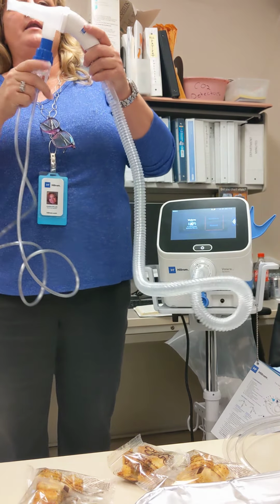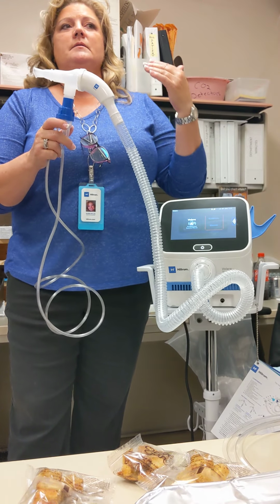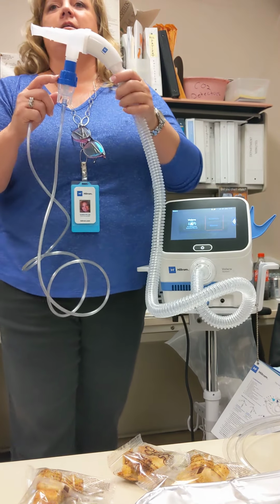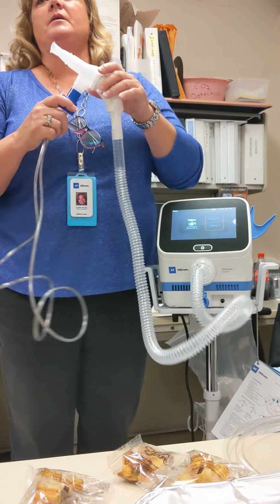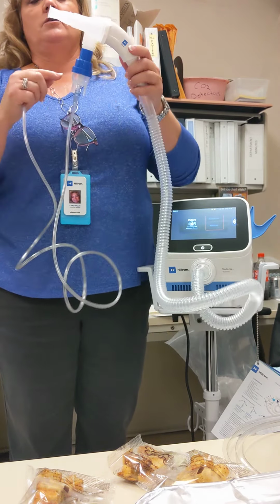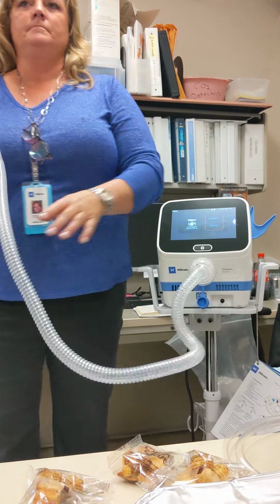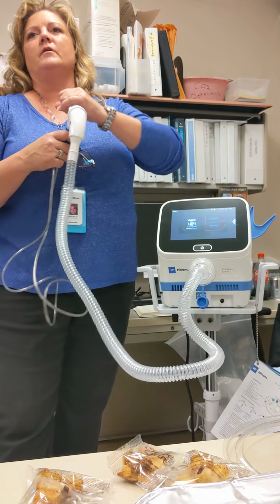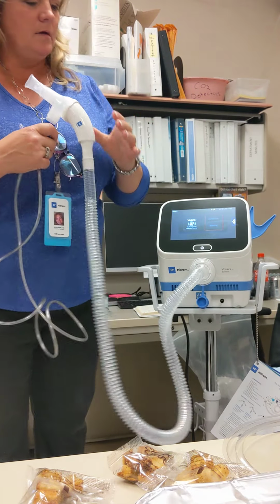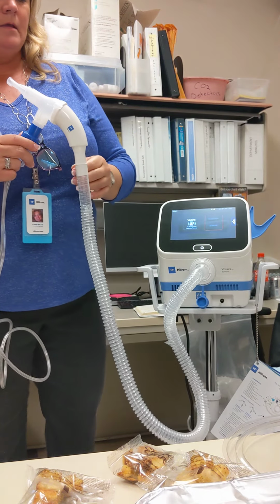But as you're going to see when you order some circuits, you're going to see a different nebulizer cup, which is a little closer to the top here. They took out an adapter. So you won't have leftover. The distance is what was creating that leftover medication in the cups. So we went through the approval of that. Easy peasy.